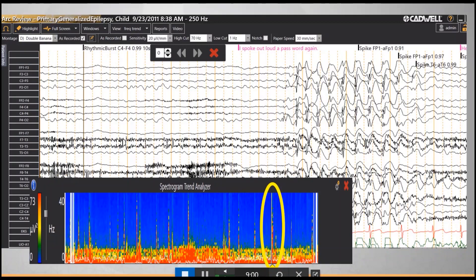Another thing the spectrogram is useful for is identifying seizure activity. In this example, the cursor in the spectrogram is placed on a peak that corresponds to seizure activity in the EEG. Not all peaks in this trend correspond to seizure activity, so it's useful to understand which ones do and which ones don't, and why.